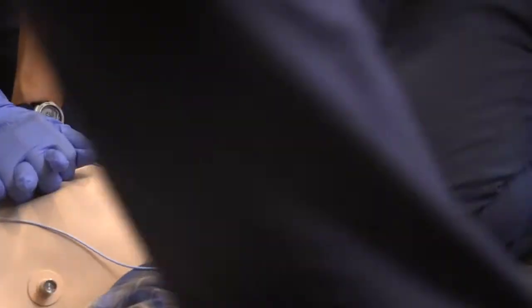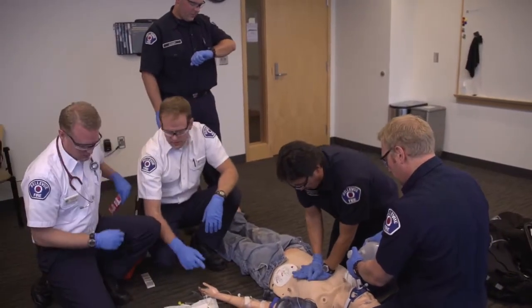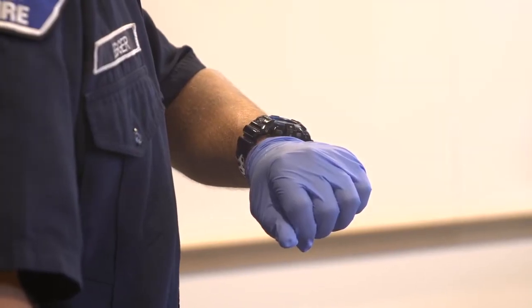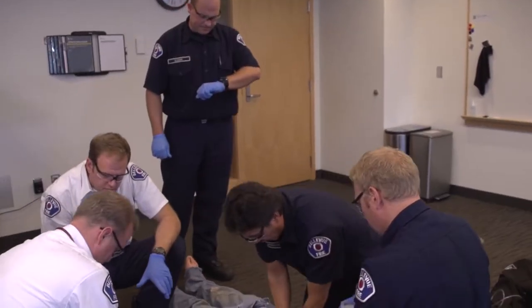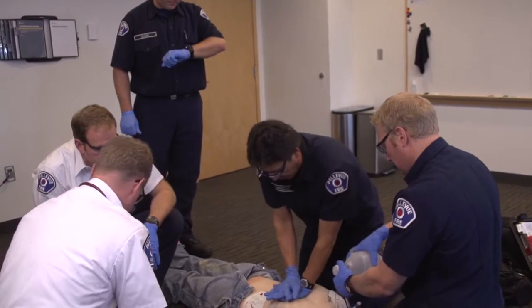Okay Kevin, I can help out with whatever you need. Why don't you drop a lidocaine. 35, 34, 33. If you want to run the machines. 8, 9, 10. Let me get up here. 30 seconds remaining. 30 seconds left, Ty. We'll go ahead and do a pre-charge. Looks like we're still in VF. We'll get that started at 15 seconds.